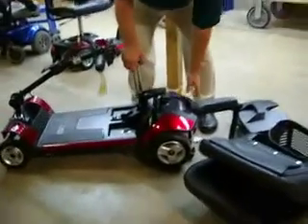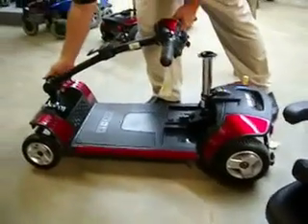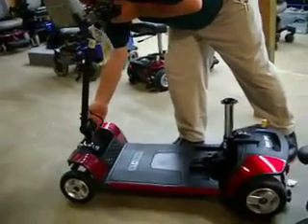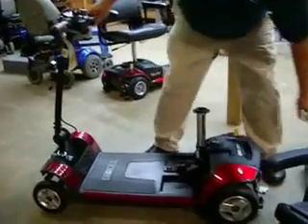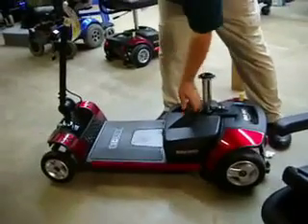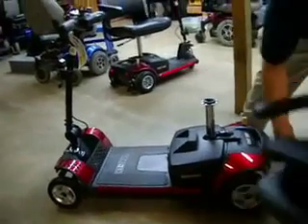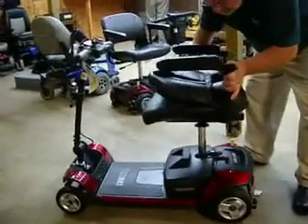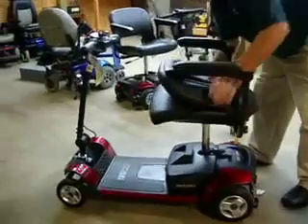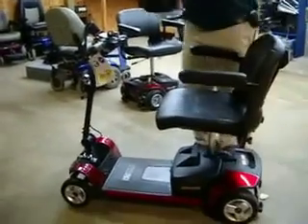Now he's going to put it back together. On the Go-Go Elite, you connect it on the back, and it has the option to raise the tiller up. Then the battery pack goes back on — it just sits on there and it is rechargeable. It comes with a charger. The seat just goes down onto the post, and the basket goes on, and that's it.